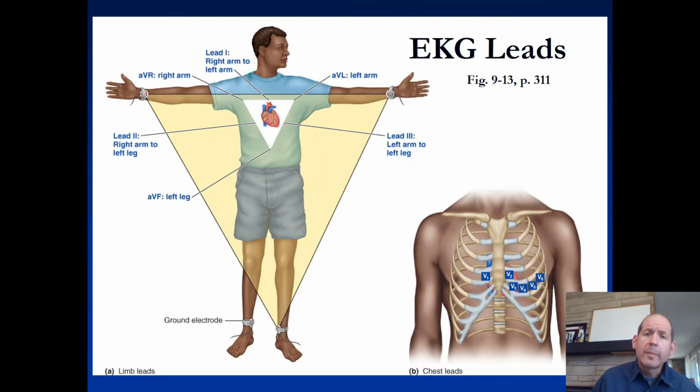Another thing you should understand about EKGs is where our recordings are. We would usually have an electrode on the right arm, on the left arm and left leg. Quite often with exercise placement, we might place them more centrally but representative of those areas. Also nowadays our electrodes are sticky, so you don't need a strap like this. And then you have a number of electrodes placed around the chest, our chest or precordial leads. And understanding which lead is positive and negative would help you to identify which direction the electrical activity is spreading.